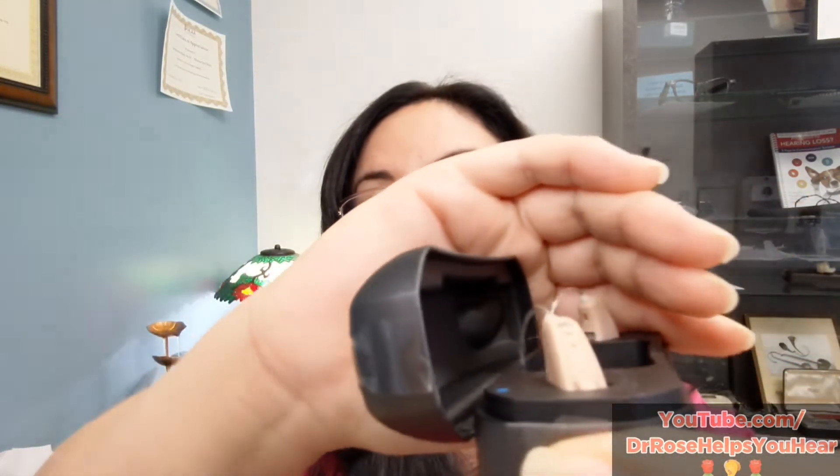If you see a green light blinking on your hearing aid while it's on the charger, that means it is getting power. In that case, there's a high chance it's either a dead speaker or just a filter that needs to be changed.